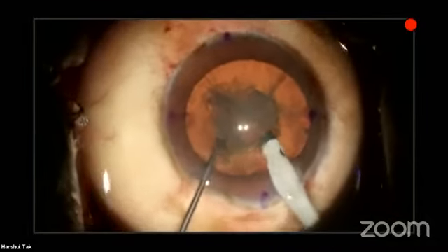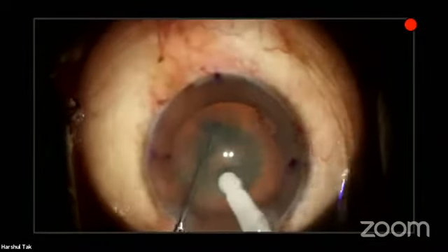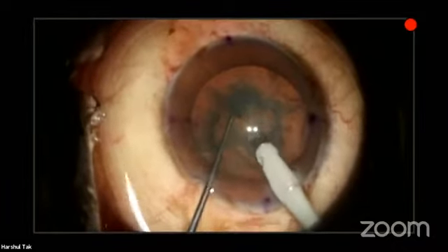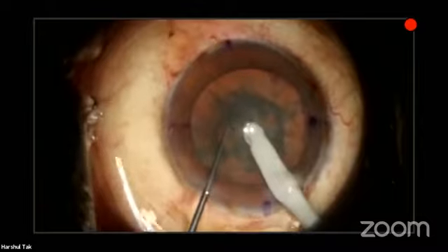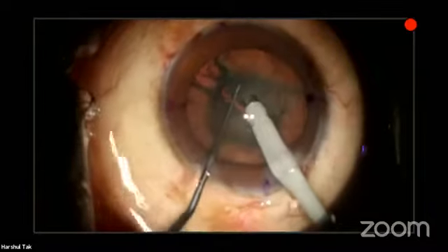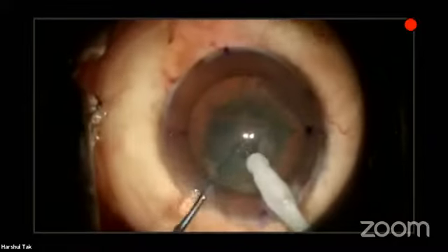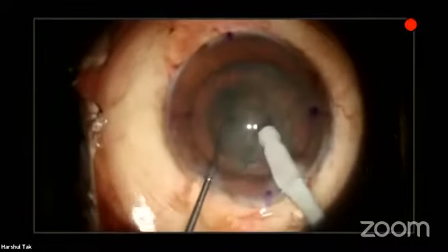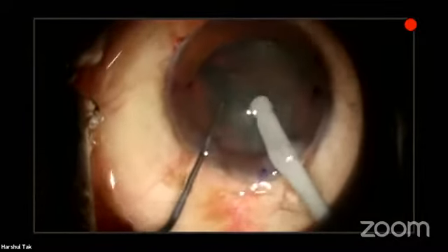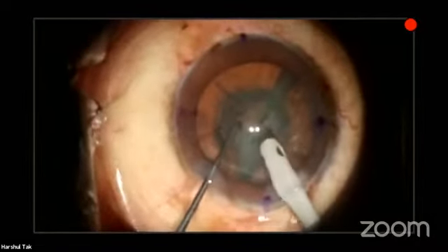Okay, never mind. So this case has a nucleus grade 3 sclerosis. I go ahead and try to rotate this nucleus. Hold this nucleus and chop it. Can you see this chop in two pieces? So it's important to get this complete division before you start the fragmentation and further removal.